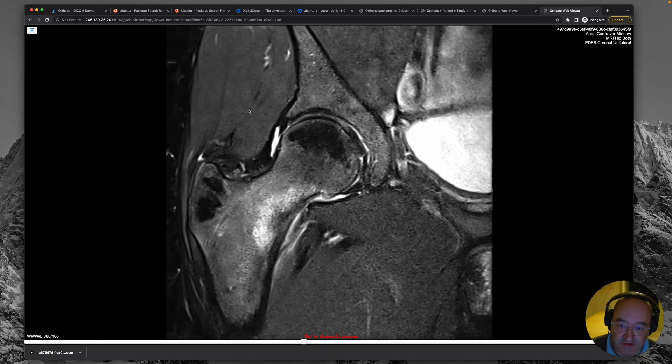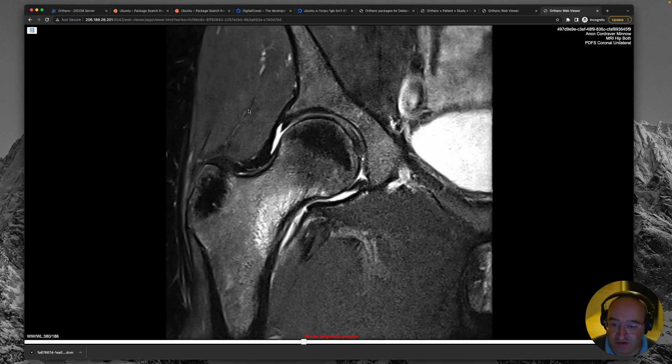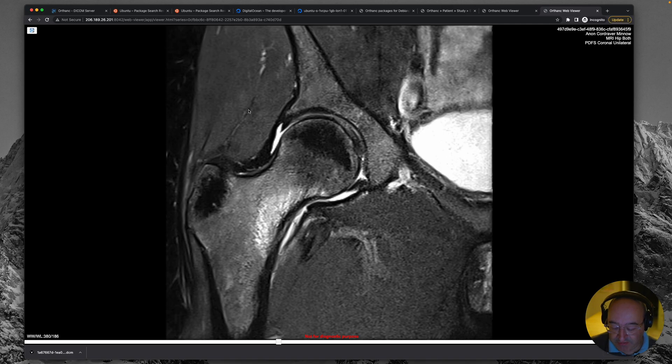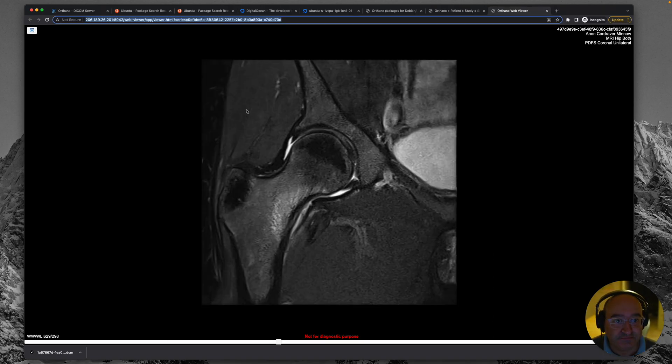So you could use this right away as like backbone of an education setup. Just uploading your images by exporting them from your packs, anonymizing and uploading. Really cool.